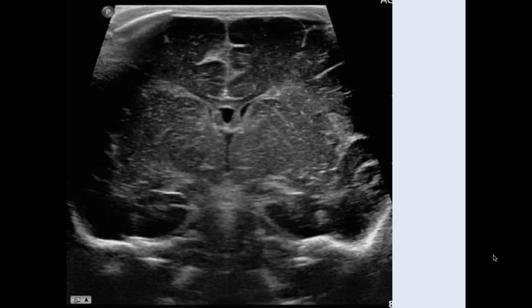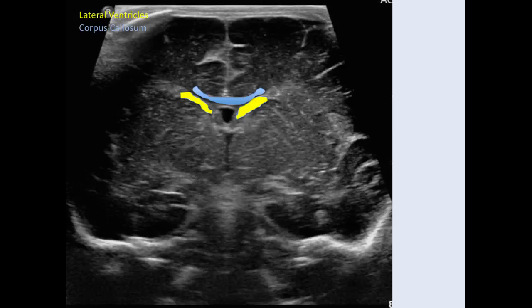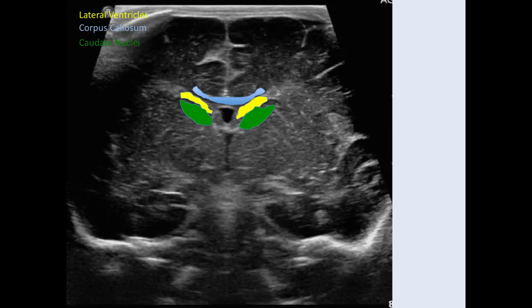A few important structures of normal anatomy in both imaging planes: the lateral ventricles, directly above which in a normal patient will be the hypoechoic corpus callosum. Inferior to the lateral ventricles are the caudate nuclei. Between the ventricles is the cavum septum pellucidum, and just below the cavum septum pellucidum is the third ventricle.